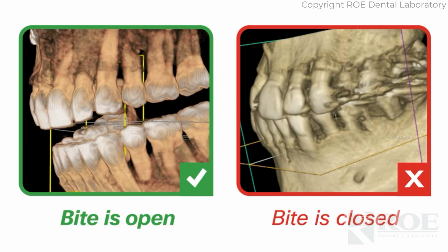Also, notice that the teeth are separated in a dentate patient. We never want them together. We cannot separate these, and we must have them separate in order to bring in the models, to register the models. So teeth open, and if this means the patient is biting on cotton rolls, or if they're biting on some other type of radiolucent material, that's fine, but most CT scanners have a bite fork. The patient can just bite on the bite fork and then stay open.